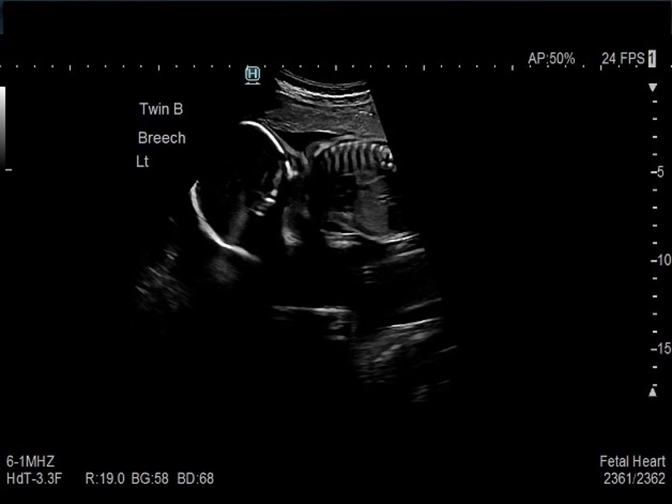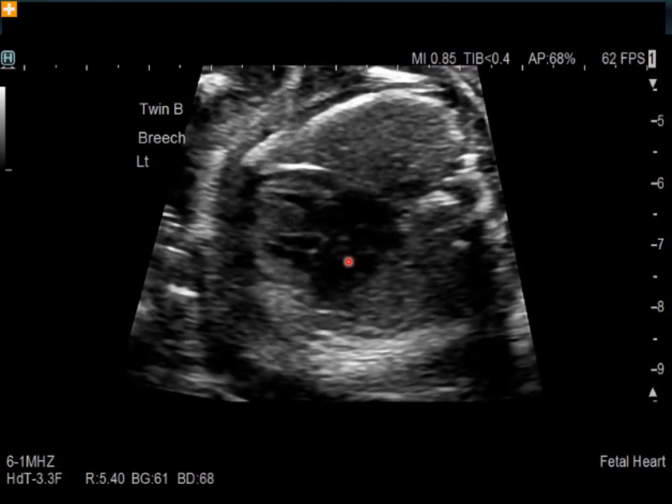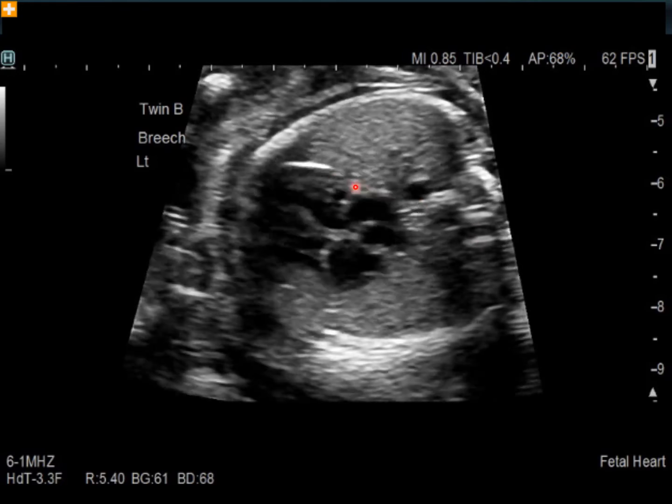and then we would move on to fetus B as shown here. Again, remember, fetus B was more of a breech presentation, and so we're seeing that. We're seeing the spine here, the head. Again, the marker is at the maternal head, and so this is a breech presentation, 90 degrees orthogonal to that view, and you are going to get this picture in the transverse thorax here, 4-chamber.